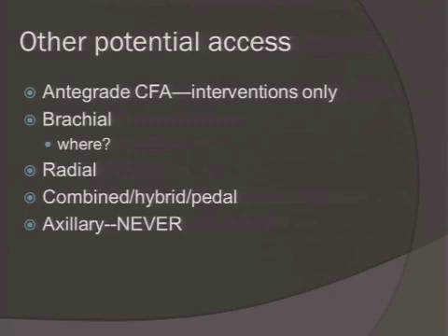Radial, I don't do those. Cardiologists, of course, are really shifting a lot more towards radial artery access. For IRs, I'm not sure if it's that big a deal. I'll just say that for so much of what we do, even visceral artery interventions, you think, we've got a downward going SMA related to the axis of the aorta. You think it might be easier to do from the arm than coming from the groin, and it may be, but it's never quite as easy as it seems. It's a lot farther distance. You're working in a little bit of an awkward location, so femoral artery is clearly the preferred.